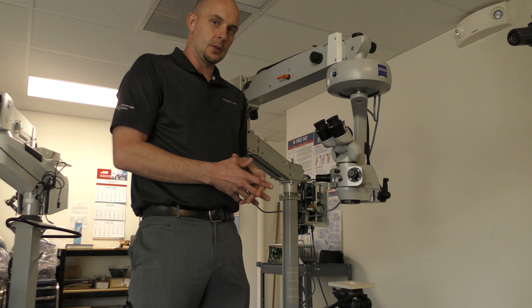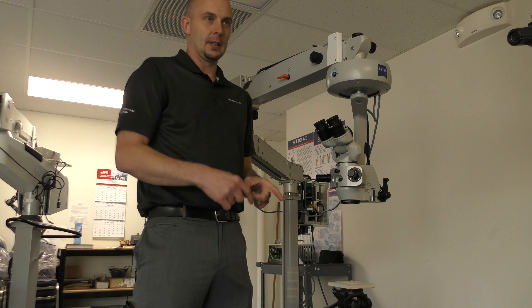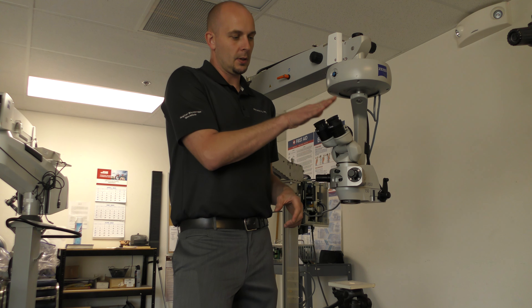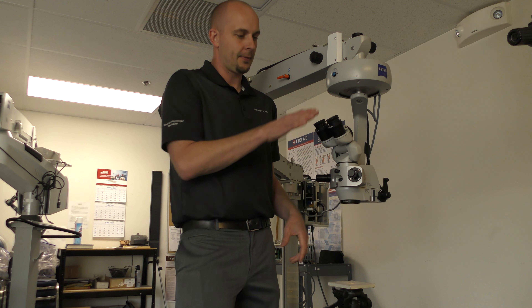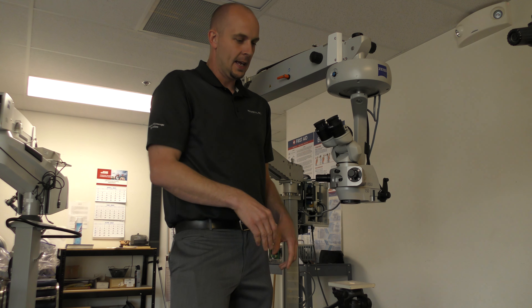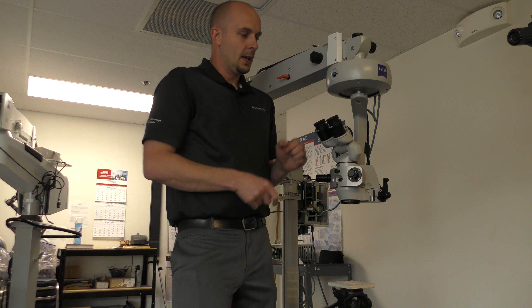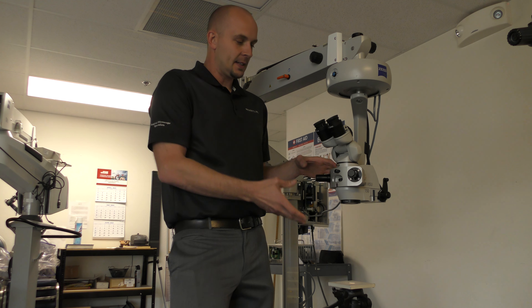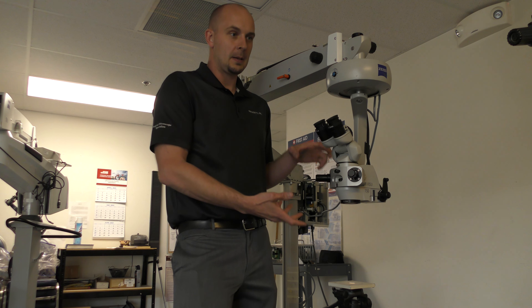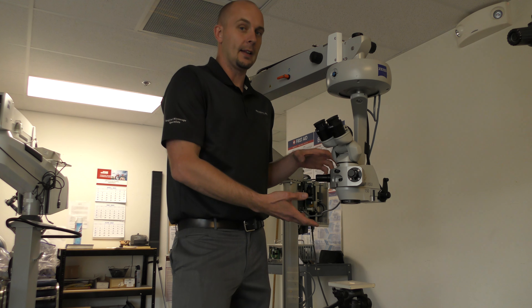In this instance, we're going to take a look at light alignments with an ophthalmology scope. In the case of the Leica spine scope, if you're seeing a discrepancy — if you align the graph in the optics to where the crosshairs are centered, and then the light is off on the spine scope — typically it's the binoculars that are the problem. On an ophthalmology scope, because of the nature of the way the mirrors are designed, if there's a light alignment issue, it's oftentimes going to be the light alignment of the head.